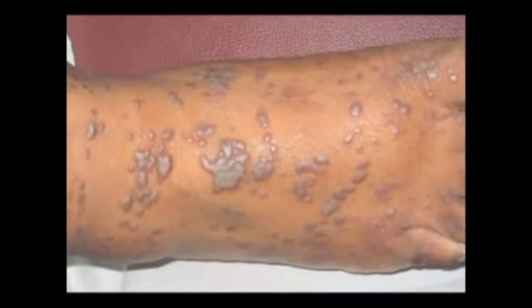A specimen taken from dependent areas such as the lower legs may have venostasis, which may confound the histologic picture. In addition, the legs often have poorer wound healing and are susceptible to infection. If you have a choice, avoid doing a punch biopsy on the lower extremities.